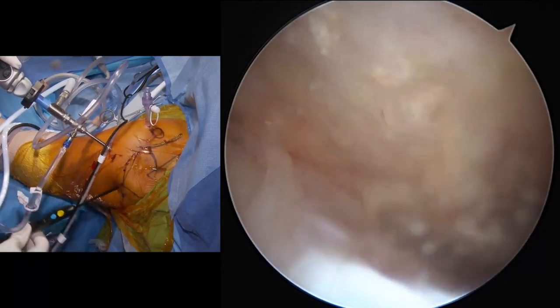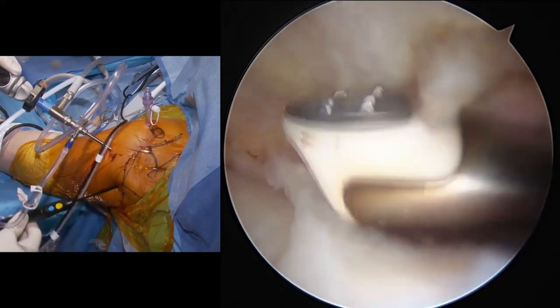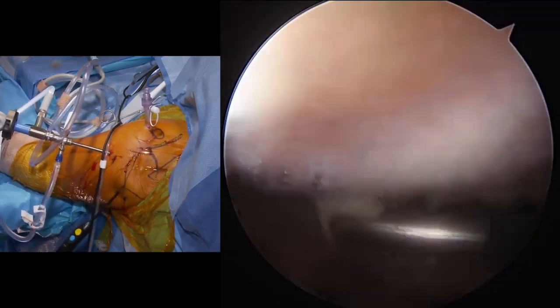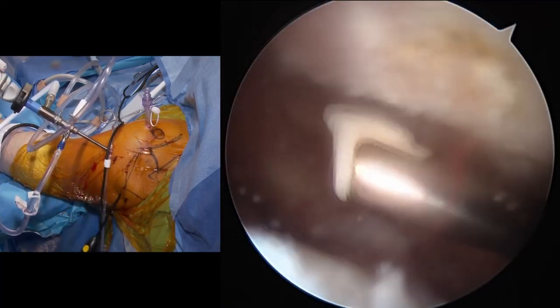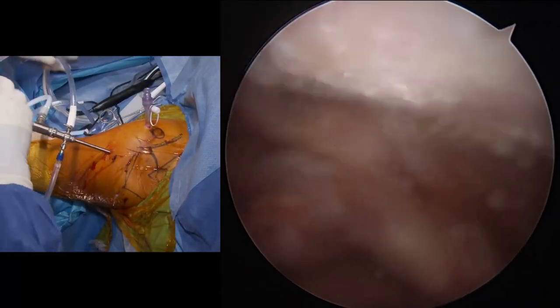This is the spine of the scapula, so that kind of tells us where the supra and infraspinatus is at. So we'll identify those two planes, and then as we come forward, we'll find the AC joint, the front edge of the acromion is here. So let's go ahead and finalize our flattening of the acromion.